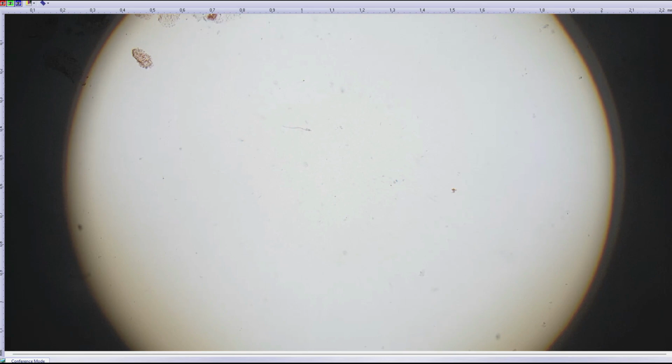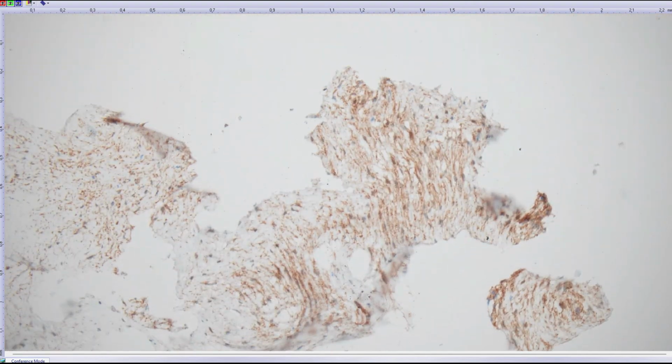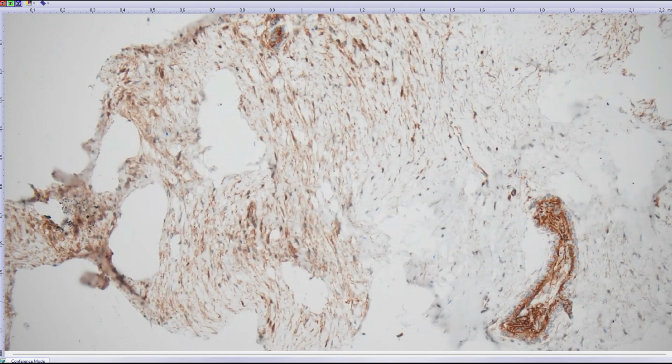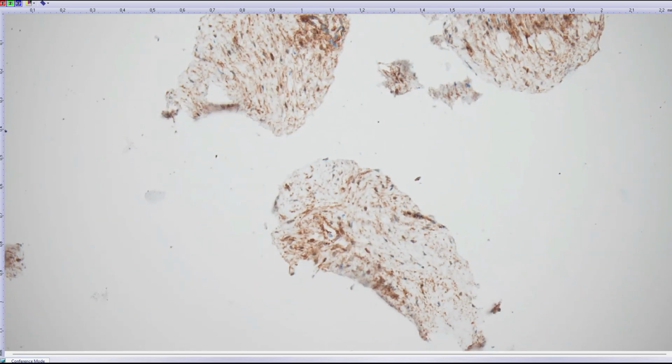So this is beta-catenin, which is, as usual, hard to read. There is always cytoplasmic staining, as in the vessels here. The vessels show a wild type staining. But the tumor cells sometimes show what is called nuclear translocation, or expression in the nucleus, which is shown here, quite convincing. So this is confirmative of desmoid fibromatosis.